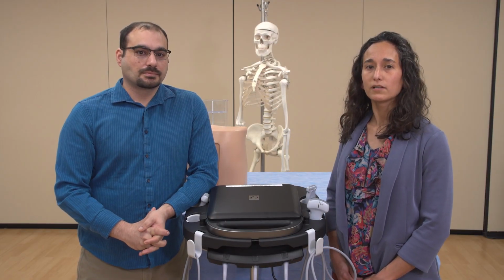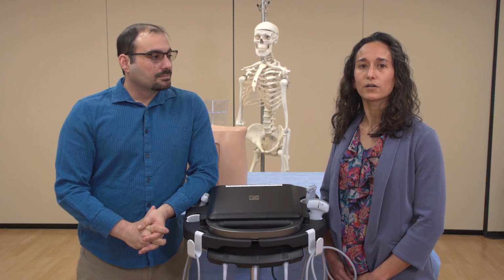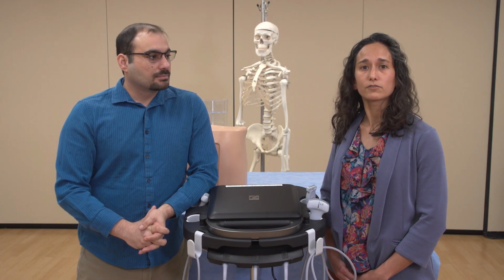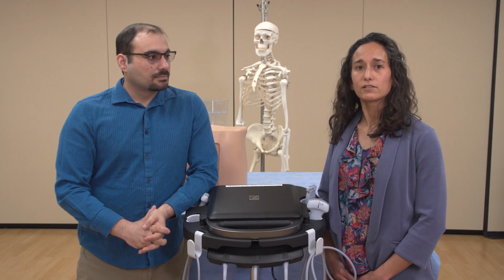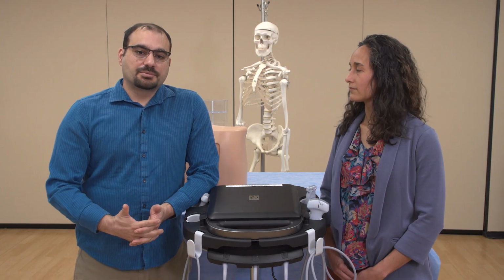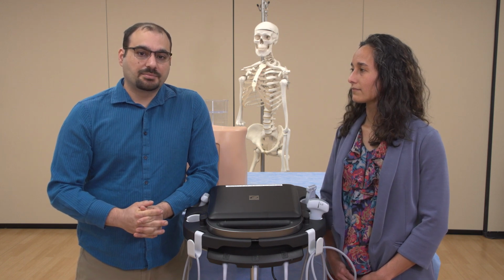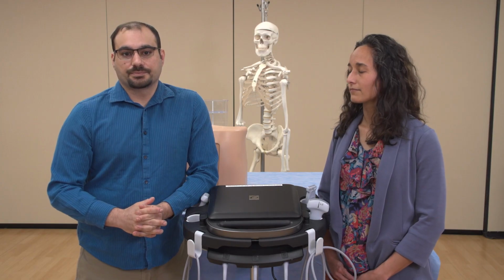We're excited to review the lumbar puncture procedure today using static ultrasound guidance as well as the classic landmark approach. To successfully perform an LP safely, we encourage all viewers to familiarize themselves with their home ultrasound device. Knowing how to adjust the preset, adjust gain and depth, as well as use the calipers for measurements are essential functions. Ultrasound has been shown to decrease the number of needle insertions and redirections, as well as increase the number of successful first attempts, specifically in patients with non-palpable landmarks, spinal deformities, or prior spinal surgeries.